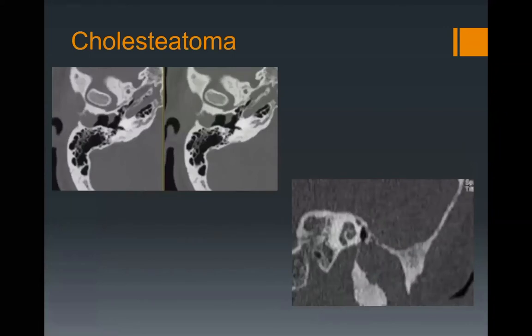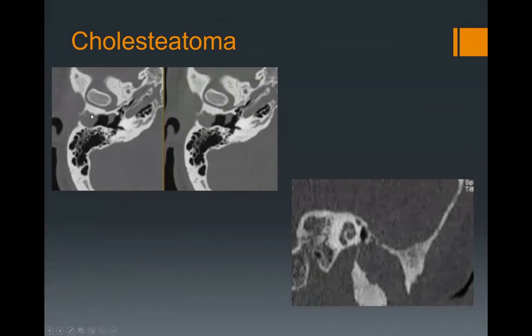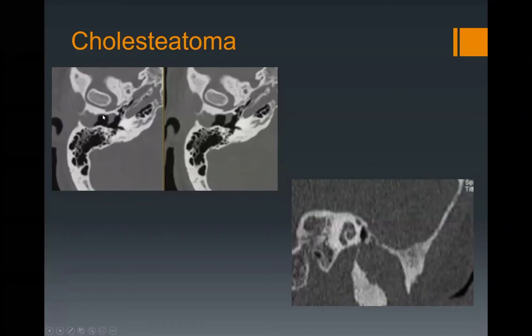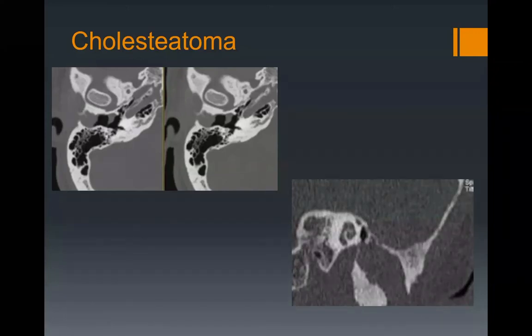Cholesteatomas can also occur in the external auditory canal — 10% of cholesteatomas actually occur in the EAC. Here you see a mass filling the EAC, and the hallmark of cholesteatomas is bone erosion and bone destruction. We see scalloping and erosion of the anterior wall of the EAC. From an imaging point of view, could you distinguish this from squamous cell cancer, melanoma, or basal cell cancer? Classically when you look otoscopically, it's a pearly white mass — the classic appearance for a cholesteatoma.